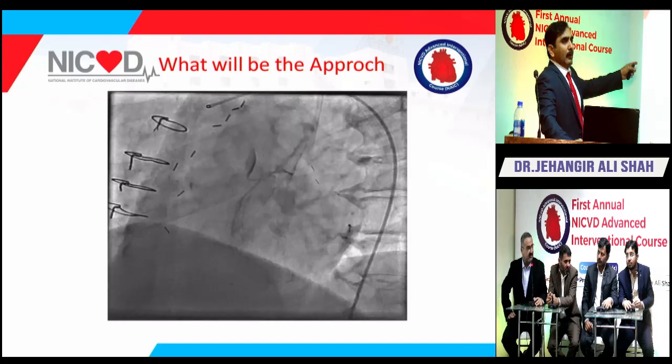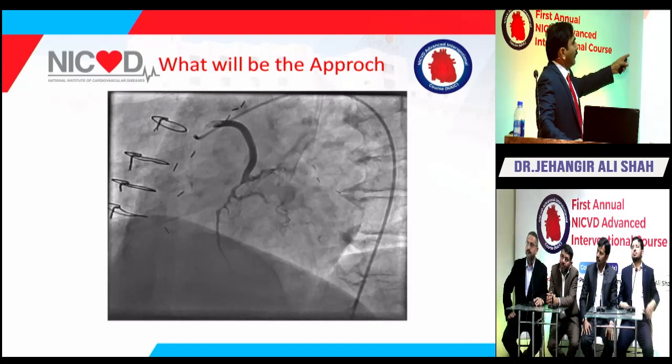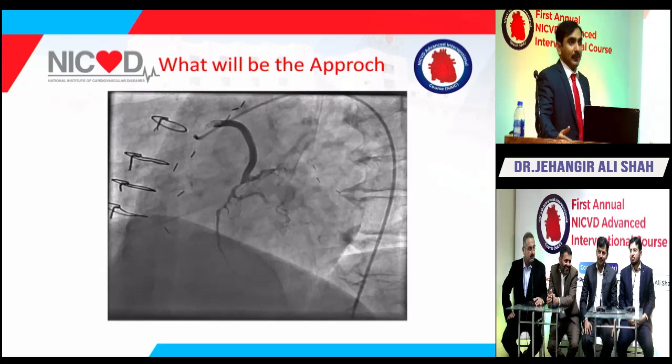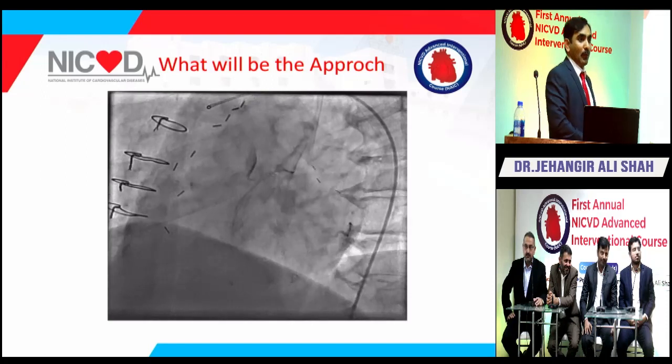So that's why I'm concerned about the use of the wire. And secondly, what do you think? Is the filter wire easily crossed? I don't know. It's easily crossed from this lesion. Either way, you may need a pre-dilatation or not.